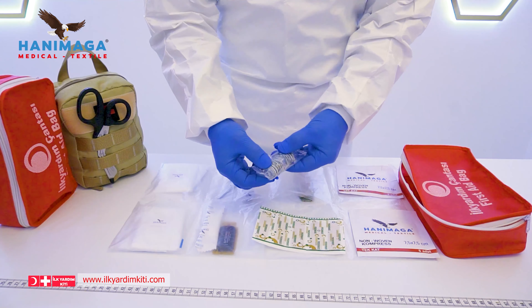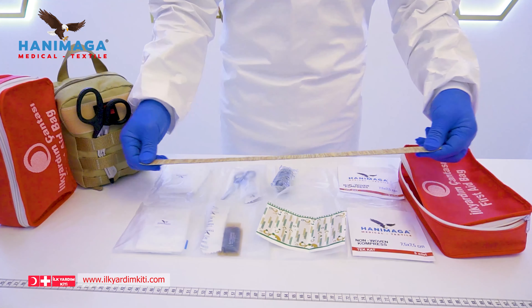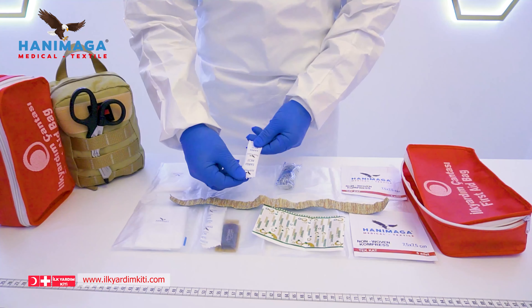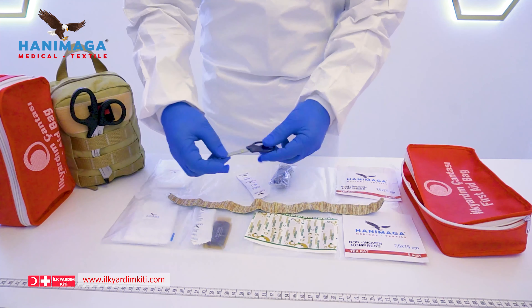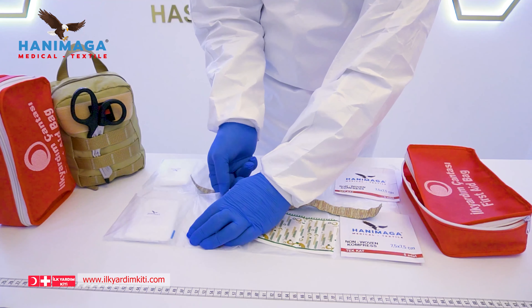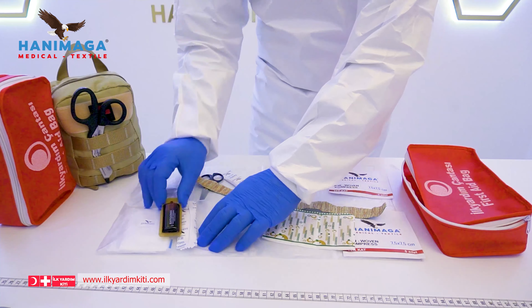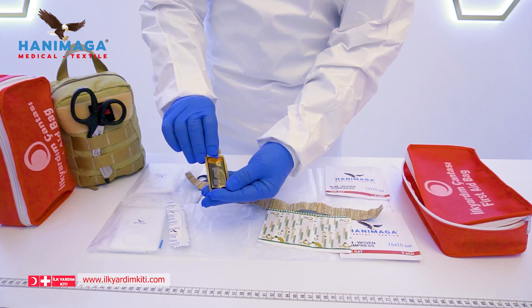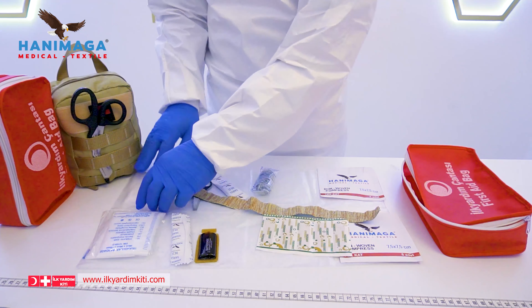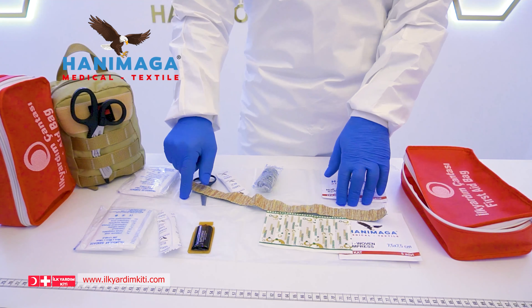An elastic bandage with metal clips. The Hanemar Medical first aid bag standard pack also includes an elastic textile tourniquet, small size hydrophil gauze, bandage shears, a big size hydrophil gauze, and two triangular bandages.